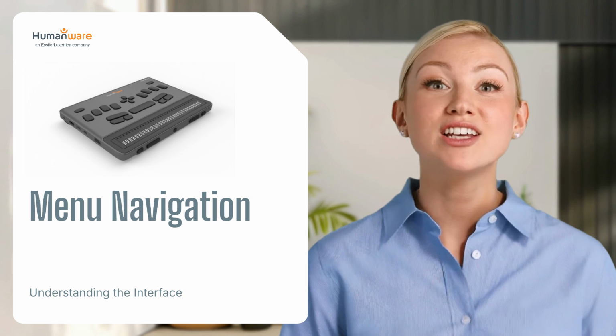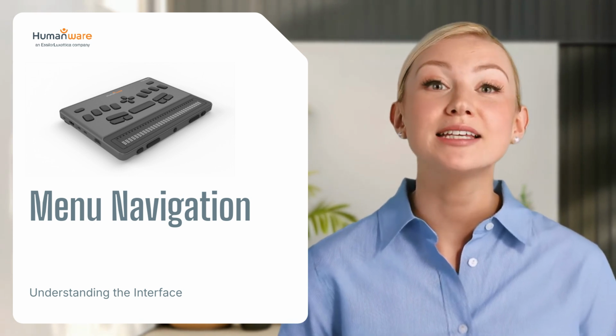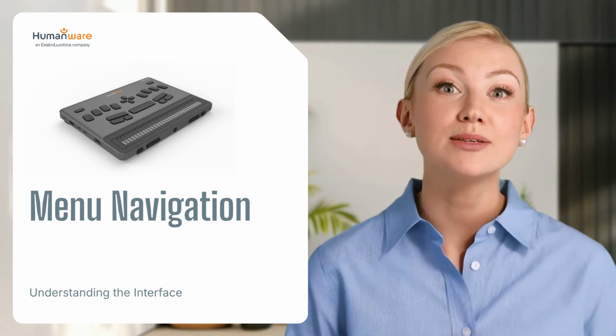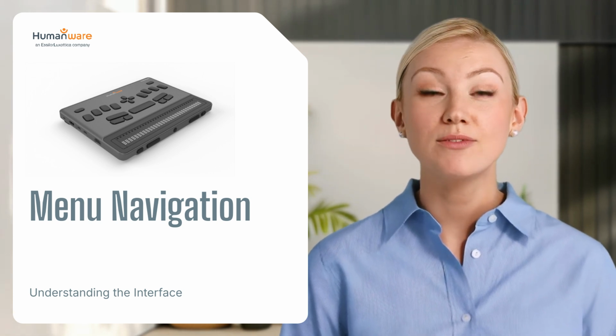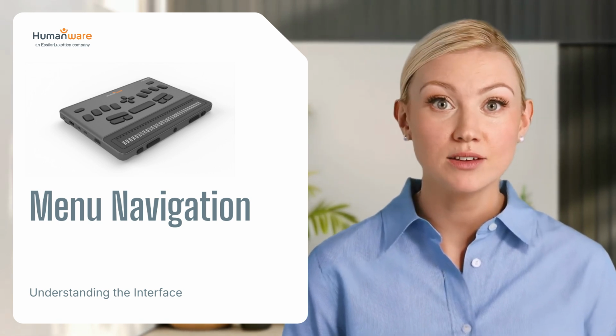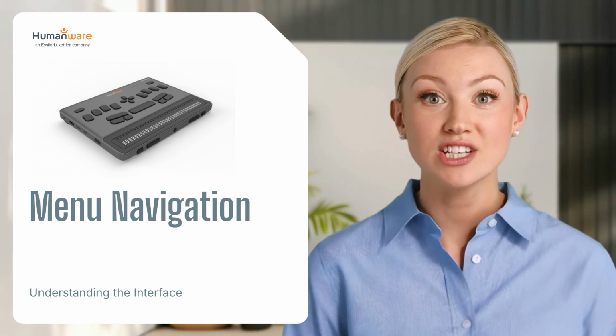Welcome to the introduction of getting to know your BrailleNote. If you are watching this video, it will likely be because you have just purchased a BrailleNote Evolve and are ready to get started. Congratulations! Before continuing with this snapshot video, please ensure you have charged your device fully as instructed in the Getting Started document.